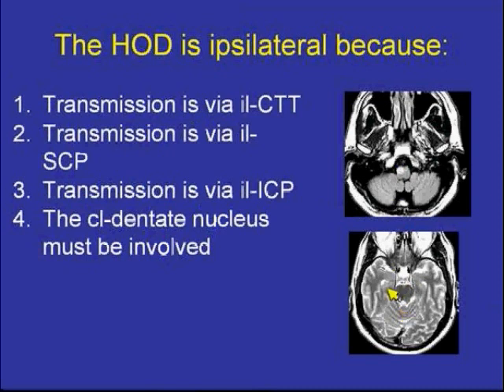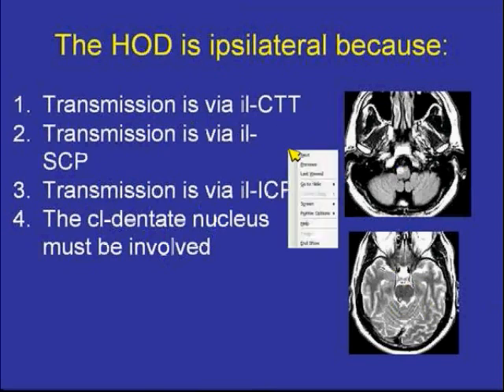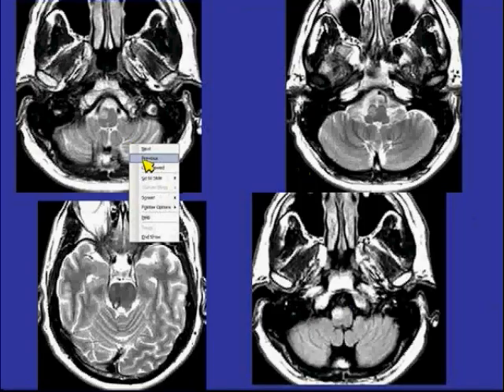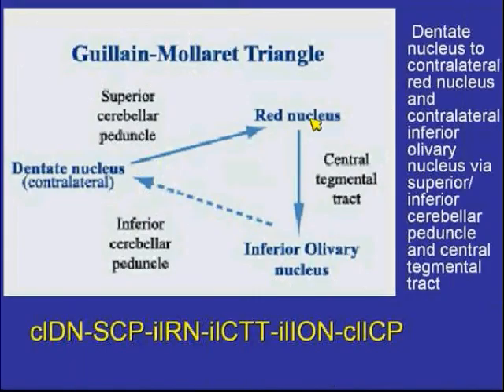This is due to involvement of the central tegmental tract. The central tegmental tract is involved with that cavernoma, leading to ipsilateral inferior olivary nucleus hypertrophic degeneration.